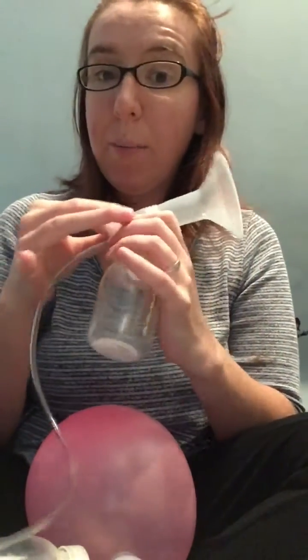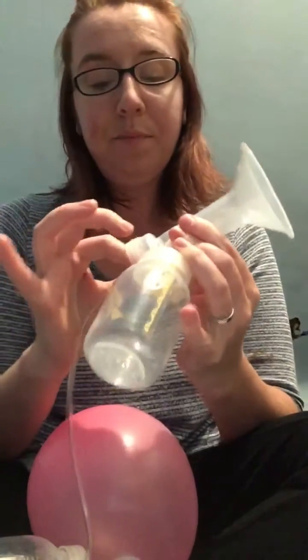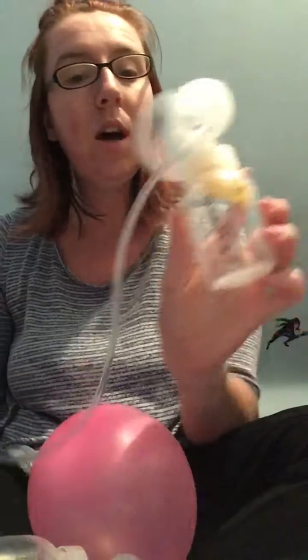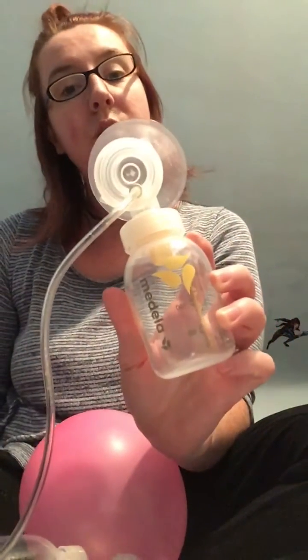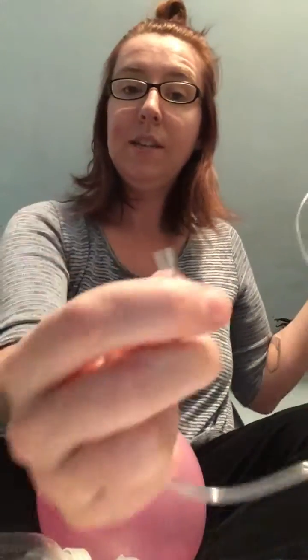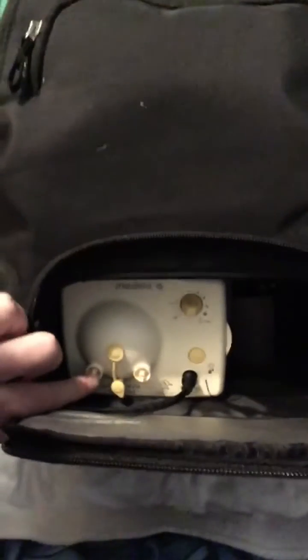So it depends on what pump you have, but this one is a pretty common pump, and mine fits right here in the back. So once you have it connected in the back, this part is all ready to go. Then all you have to do is take this piece and you are going to plug it inside of your pump right there, right on this part right here where I'm pointing. I'll show you that really quickly.